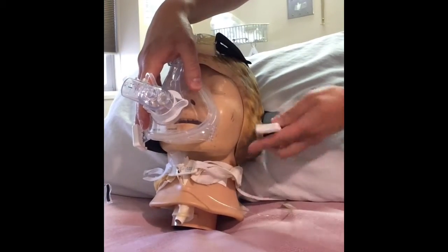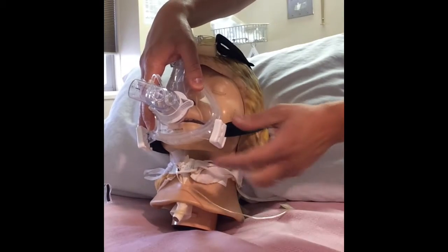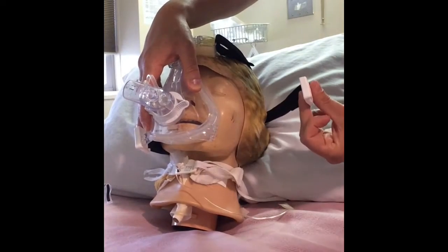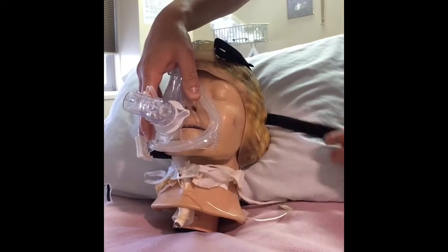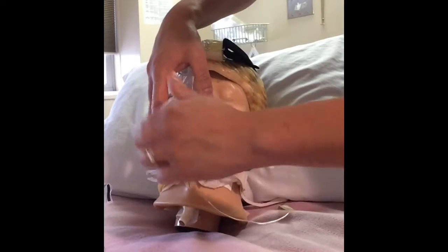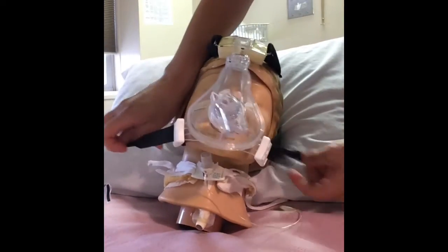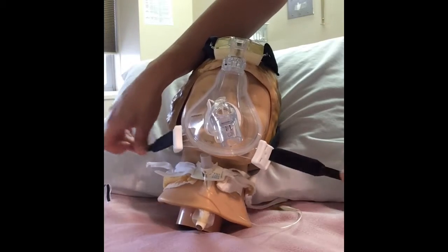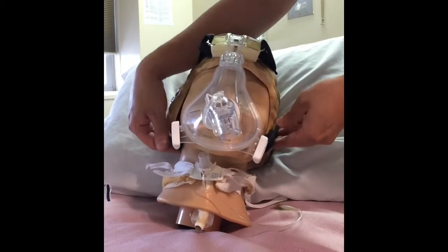You can see that the clips, all you do is just push them on. To take them off, you just put a finger behind it and just pull it off. Okay, that's super easy. So now that I have everything ready to go, I try and tighten at the exact same time on both sides, and it's not too tight. It's very small increments on tightening it.